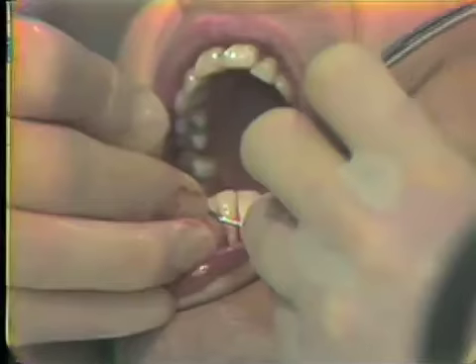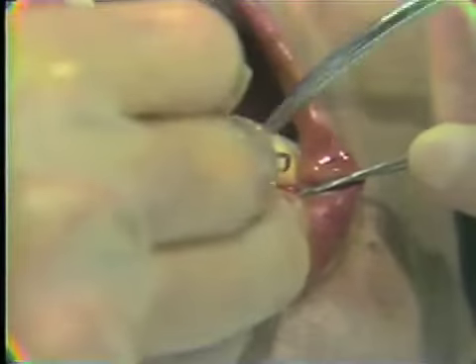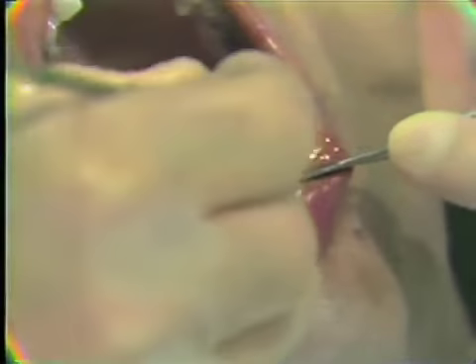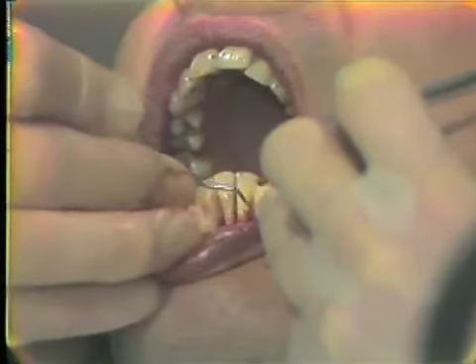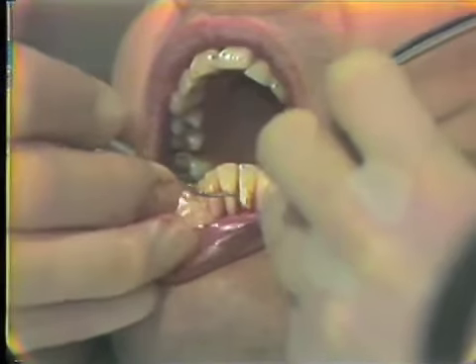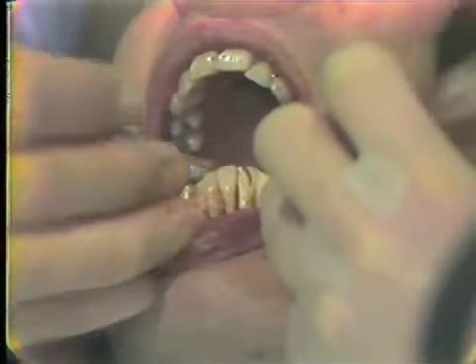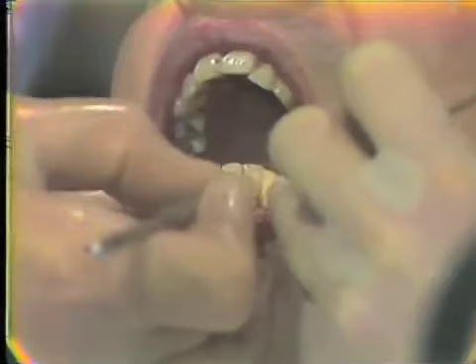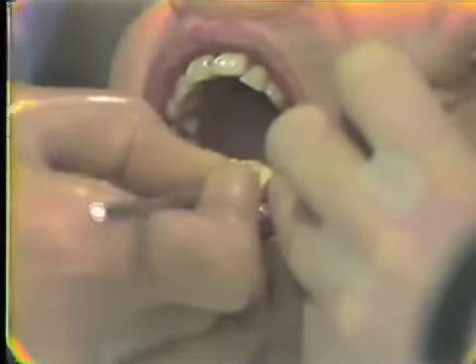This is desirable as opposed to placement of the surgical reflecting instrument on the tissue flap, because in that case, with the movement of the metal retractor back and forth across the tissue, the area is more unstable, there is more trauma to the tissue flap itself, and with placement of the retractor directly on the alveolar bone, a more stable reflection of the flap is possible, and at the same time then I have a more clear view into the one defect that we're concerned with in this case.